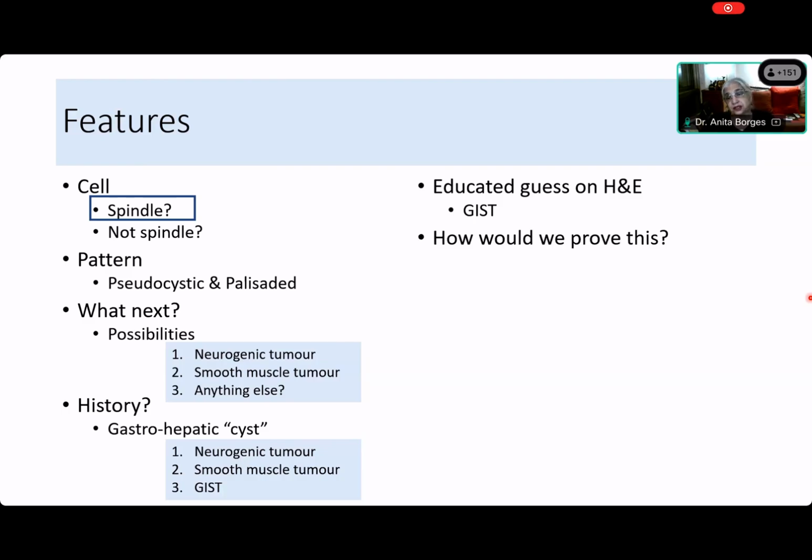So how would we prove this? Ma'am, immunohistochemistry. All right, so what immunohistochemistry? Ma'am, C-kit and DOG1. So straight away you want C-kit and DOG1. Do you want to do anything else? Ma'am, these are more specific. And suppose it turned out to be negative for C-kit and DOG1, then what would you do? S100. Then you would do S100.